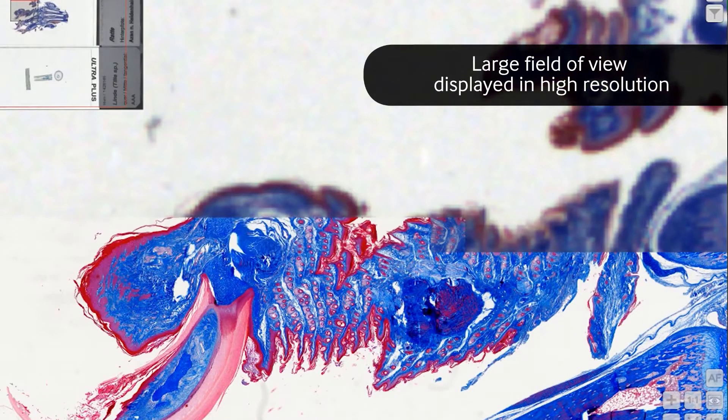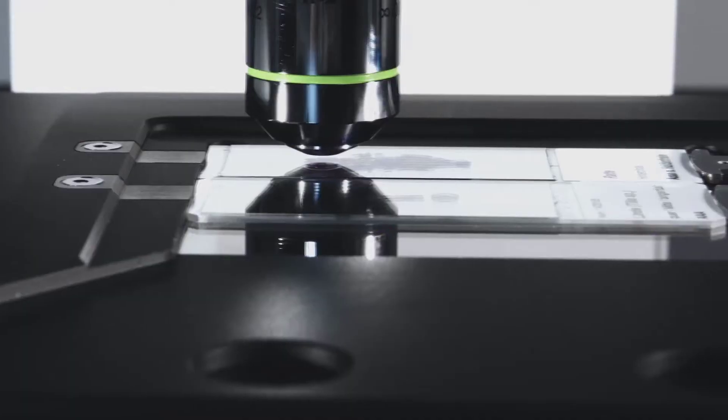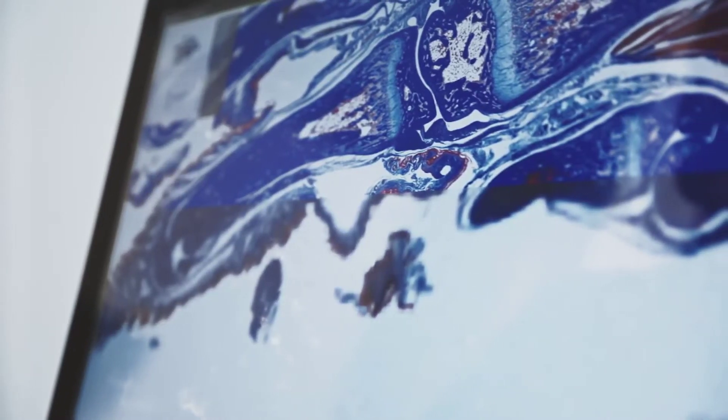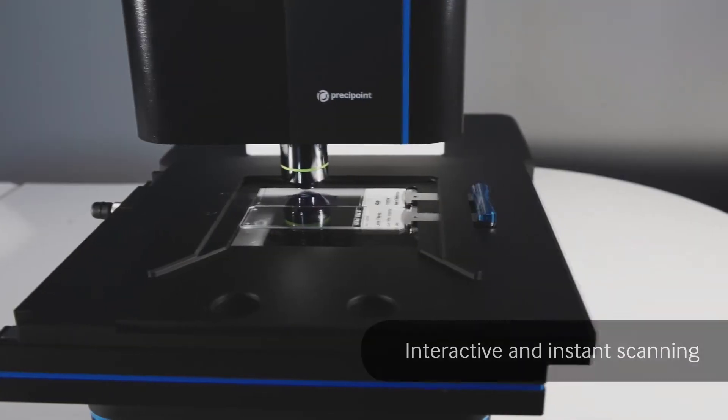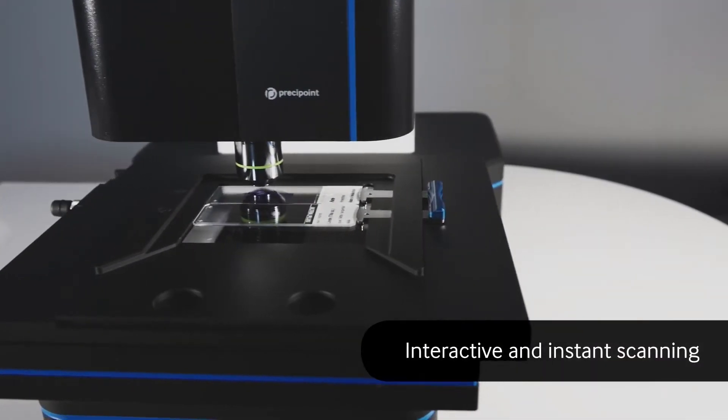Consisting of many combined high-resolution images. Never seen before in microscopy, this is what we call interactive and instant scanning.